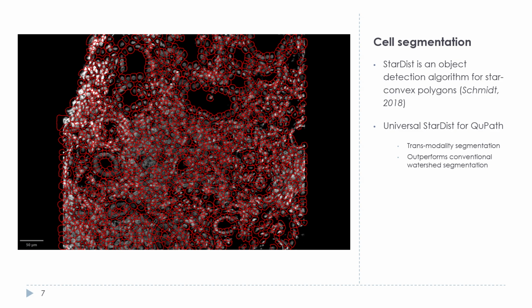And further developing this as a tool for QuPath, I've been able to segment H&E, IF, IHC, and even Hubble Space Telescope images, as well as offer GPU-accelerated segmentation. So this tool is free to use and available on my GitHub repository as well as the QuPath forums.